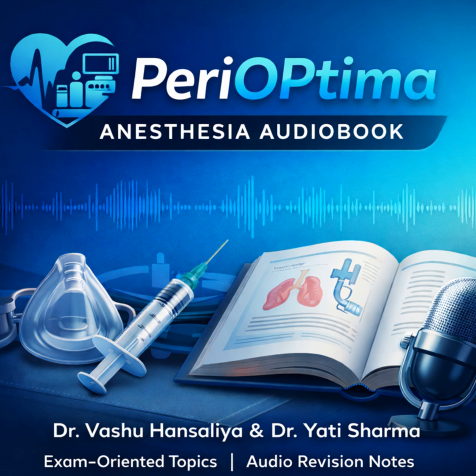That's huge. It is, but we have to address the major limiting weaknesses, the things that really spurred the next generation of devices. Okay, the downsides. Absolutely. The 2 points that must be stated are the low seal pressure and the lack of aspiration protection. The classic LMA typically only achieves a seal pressure of about 20 centimeter H2O. Just 20. Yes. So any need for higher inspiratory pressure, say due to low lung compliance or high resistance, will lead to a leak. That compromises ventilation and increases the risk of gastric insufflation. And while it's better than a face mask, it provides no definitive protection against aspiration.